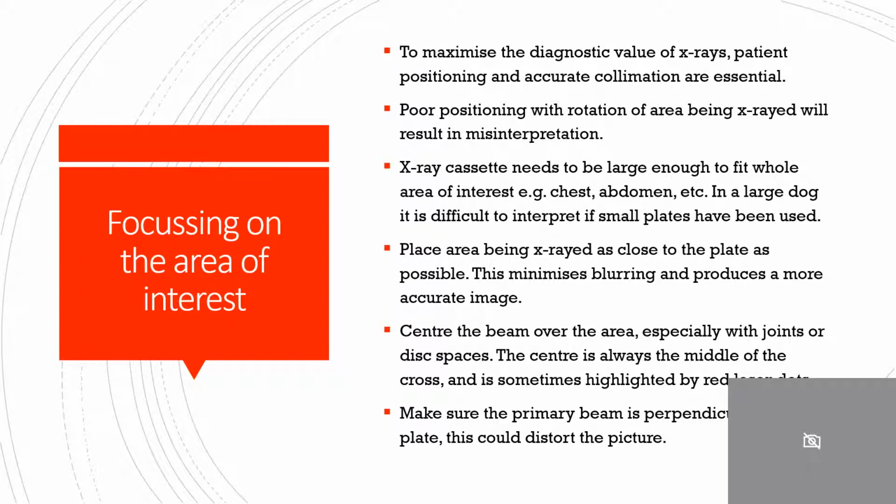Focusing on the area of interest. To maximise the diagnostic value of x-rays, patient positioning and accurate collimation are essential. If we have poor positioning with rotation of the area being x-rayed, it will result in it being misinterpreted, which could be very, very poor in relation to being able to diagnose a situation.